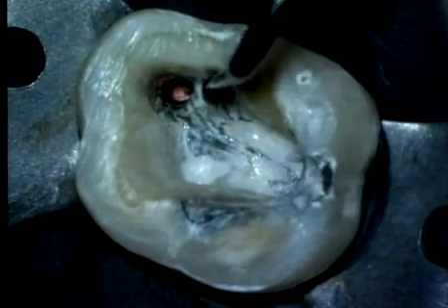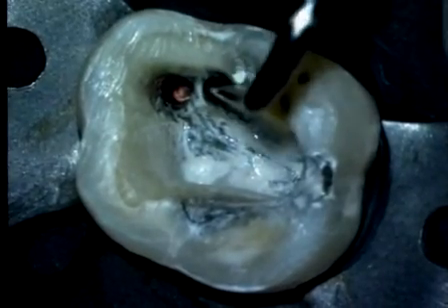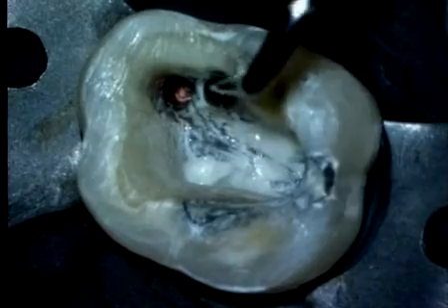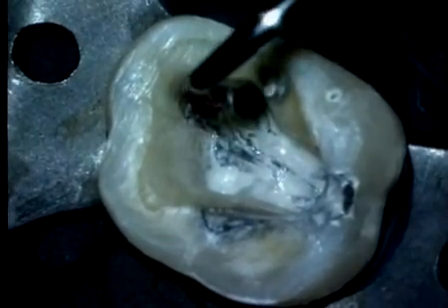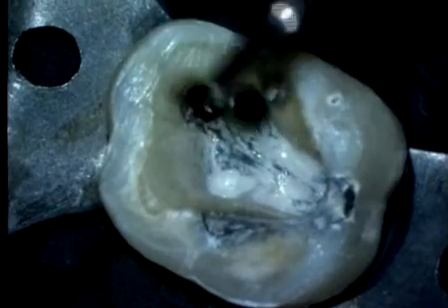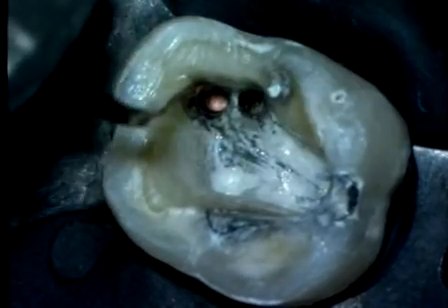Notice as we pack, we can drive gutta percha through the anastomosing back into the MB1. At the conclusion of the down pack, the gutta percha is leveled off in the MB1 and MB2 systems. We're now ready to backpack.